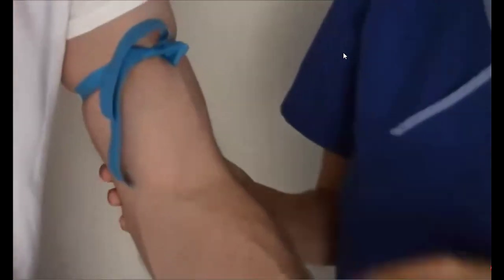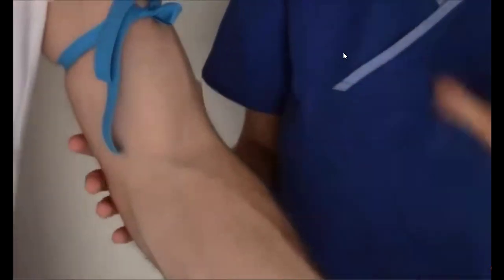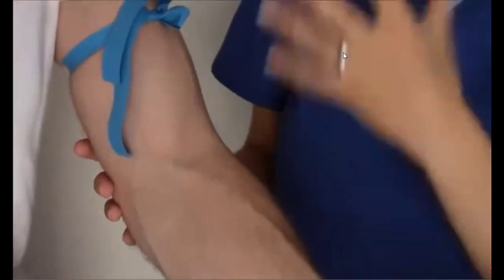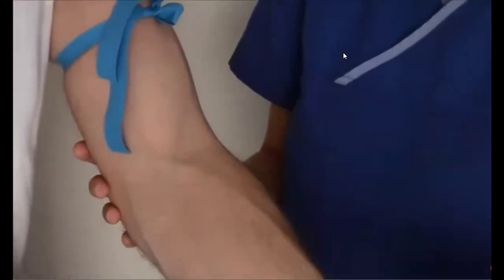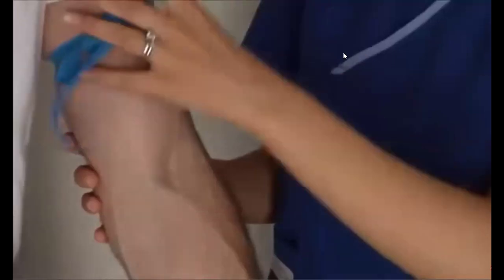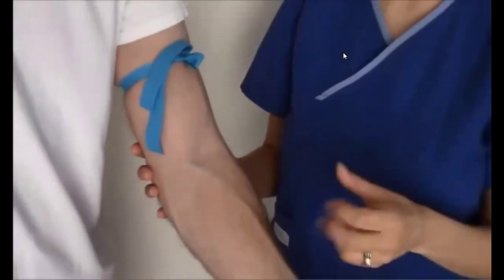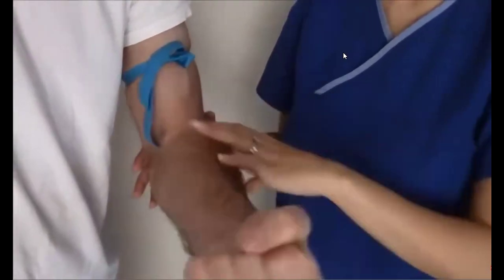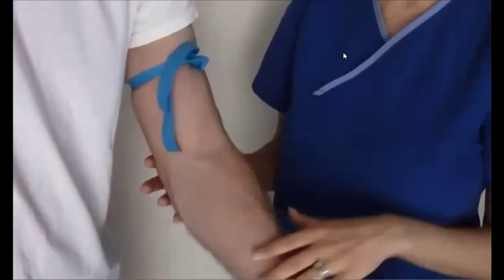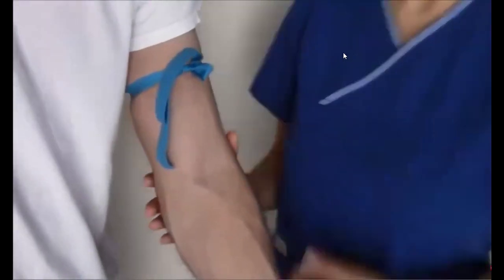And already these veins are starting to collect with blood and become engorged. Two tips to help engorge the veins the best you can. Have the patient lower their arms so the blood pools down to the extremity. Next, have the patient pump their hand. This causes the blood to really pool. Okay? So they get nice and engorged, and compared to before, these veins have become more engorged.